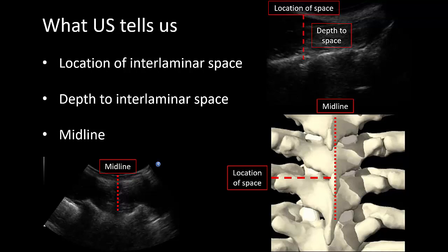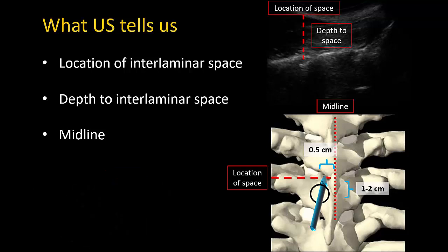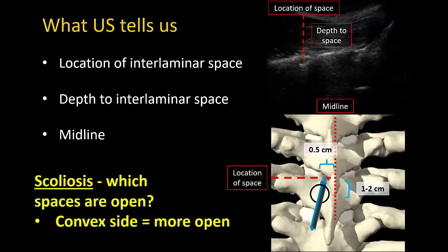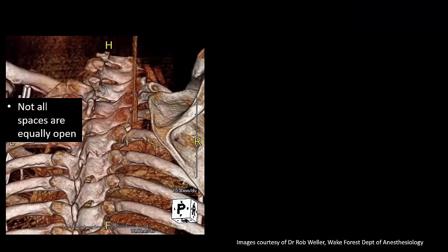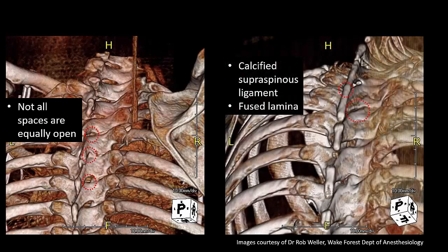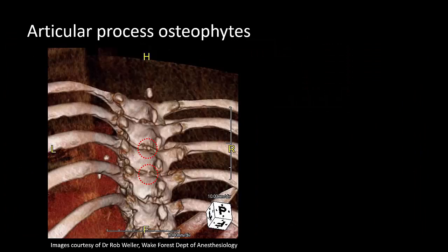I recommend a needle insertion point approximately half a centimeter away from the midline, to avoid an excessively large lateral-to-medial angle, and one to two centimeters inferior to the plane of the interlaminar space, which will allow for a cranial angle of 50 to 60 degrees. Imaging is even more helpful if there is a scoliotic deformity, as scanning on both sides of the spine will allow selection of the side where the interlaminar gap is more prominent on ultrasound. Note that degenerative disease of the spine with osteophyte formation can result in narrowing of some intervertebral spaces or even complete closure, which will not be evident without imaging.